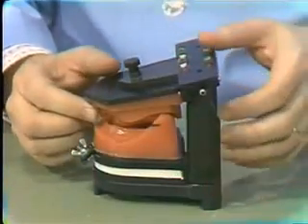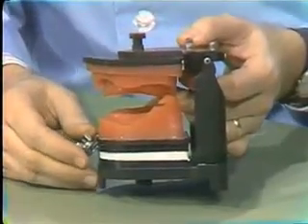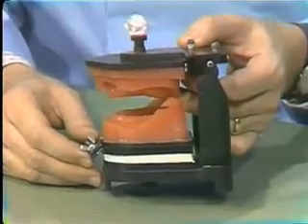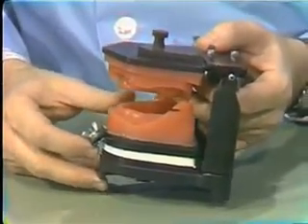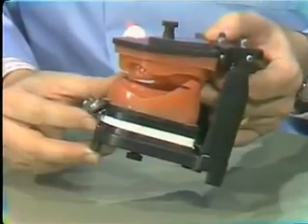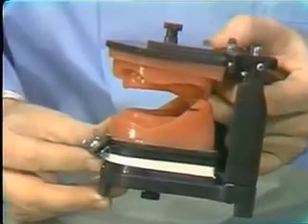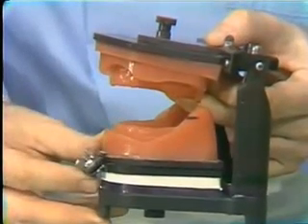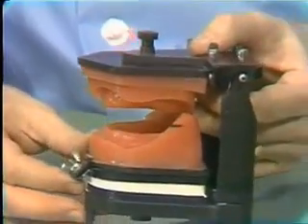In the edentulous patient, it is necessary to determine how close the jaws should be to each other when the patient's teeth are together, when the dentures are together. Now, as in the mannequin, there is no third point of reference holding the jaws apart. This has to be determined. Is the patient overclosed with an old set of dentures, say? Is the patient at about the right vertical? Or has a set of dentures been made for the patient that holds his jaws too far apart? We have to determine the correct occlusal vertical dimension.